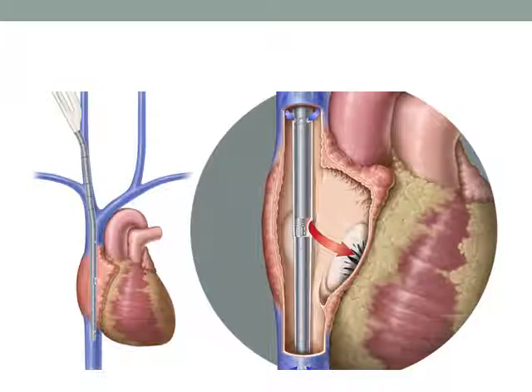It provides hyperoxygenated blood that has already had carbon dioxide removed to the right atrium and right ventricle, allowing that blood to be pumped through your dysfunctional lungs and out to the body. Okay? That's fundamentally the concept here. Anybody not understand that? It's time to take a short break and explain that, because if you understand that, then VV makes sense. Understand what we're doing there? Okay.